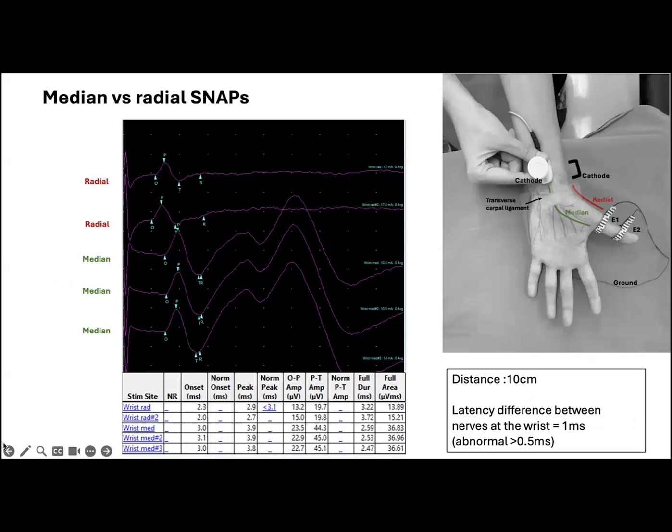Let me start by giving you some examples. These are antidromic median and radial nerve conduction studies, stimulating at the wrist and recording at the first finger, with a distance of 10 centimeters, in a case of median neuropathy at the wrist. The first two tracings represent radial snaps, where the stimulus intensity was gradually increased.